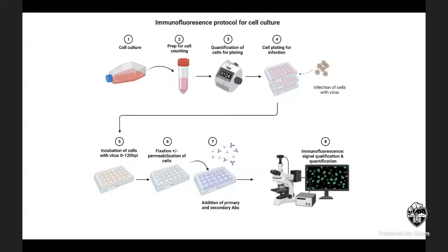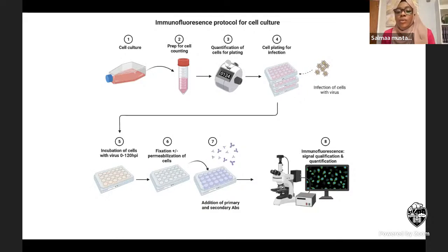I always have a problem with the autofluorescence when I'm staining with fluorescent antibody, not chromogenic. So there is another control that I should have added to my list of controls. It's called the endogenous tissue fluorescence control, because yes, there are cells that have this autofluorescence and they can interfere with your signals.